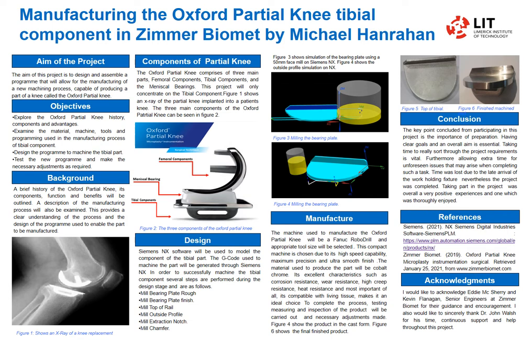The design is going to be done on Siemens NX. The main sections are the mill bearing plate rough, the plate finish, the top of the rail, mill outside profile, mill extraction notch, and mill the chamfer.